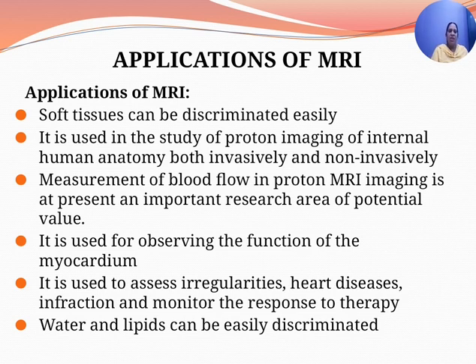These are the applications. Soft tissues can be discriminated easily, and MRI can be used to diagnose stroke and tumors of the brain.